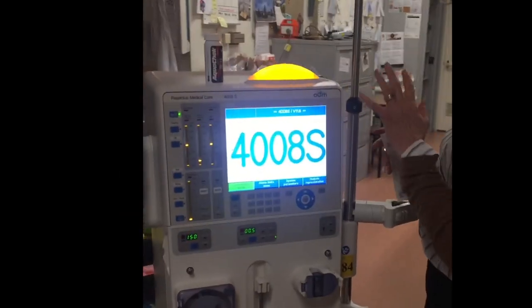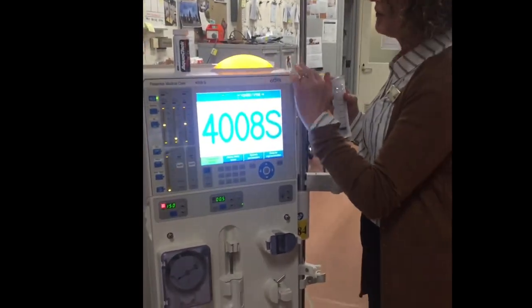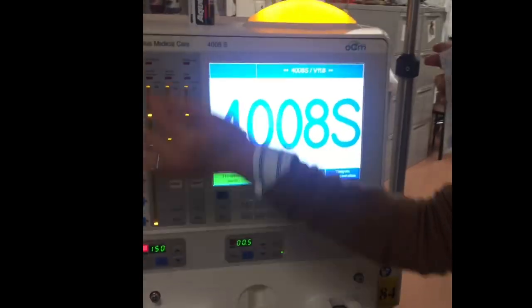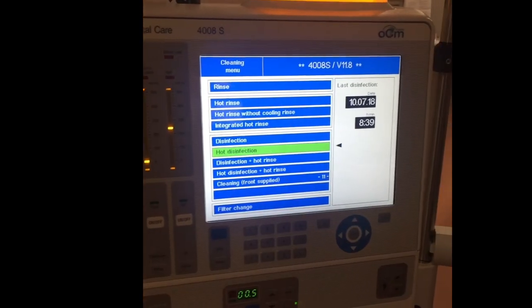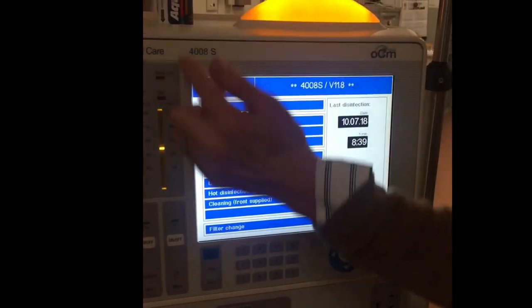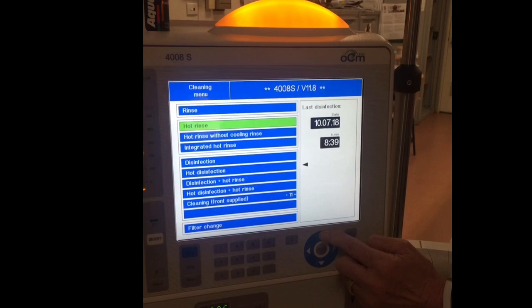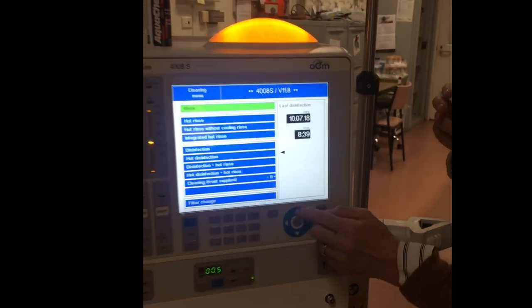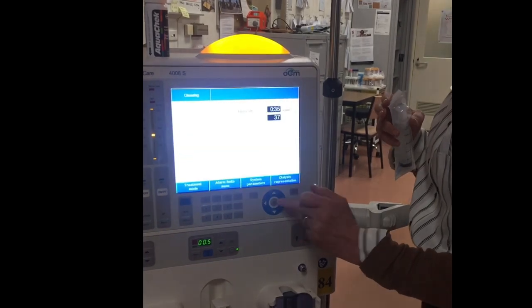After the cleaning has finished at the end of the bleach cycle, you will have a mandatory rinse end. The instructions then tell you to go to 'Cleaning' and do another 16-minute rinse. Using the arrows, bring up the rinse and press confirm. The machine is now in a 16-minute rinse.